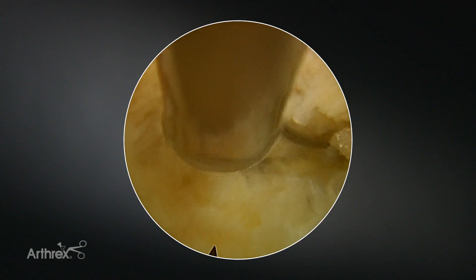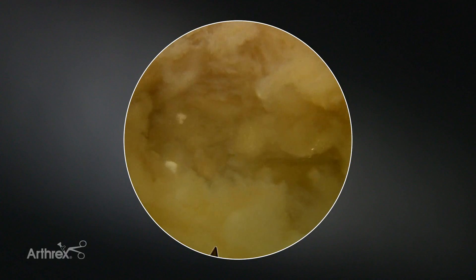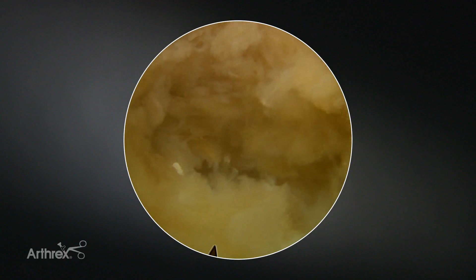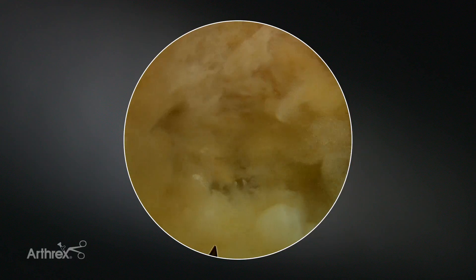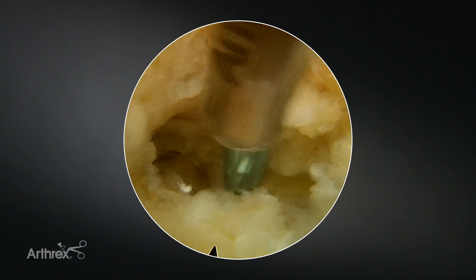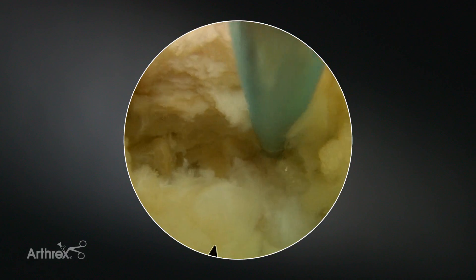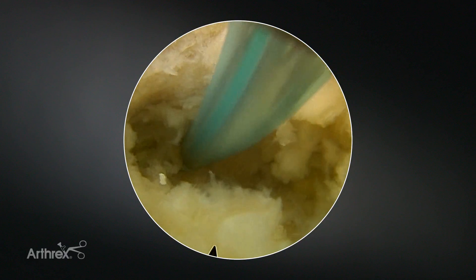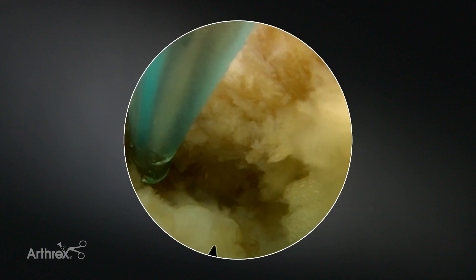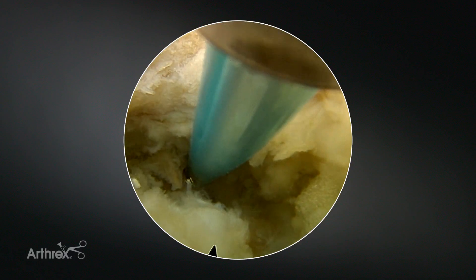As I reach upward, there's a little bit of epidural fat, which means our traversing nerve root is right on the other side of that fat. You can see the fat is starting to float a little bit when I pulsate the inflow — so it's slowly decompressing. Ultimately, what you'd like to see is actually the nerve on the floor of the canal. Sometimes there's epidural fat in front of it, so between inspection, palpation, and just looking at it, you need to determine whether it's worthwhile to dissect off the fat to clearly see the root, or whether you have a good enough feel that this is open. You can see I can go from the back of the L4 body to the back of the L5 body with no obstruction, and I'm all the way to the midline — so this spot is decompressed from the foramen to the midline. That's actually the PLL — you can see the lateral bands of it right there. And that's your transforaminal approach.